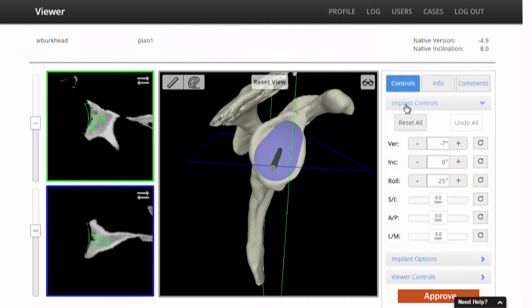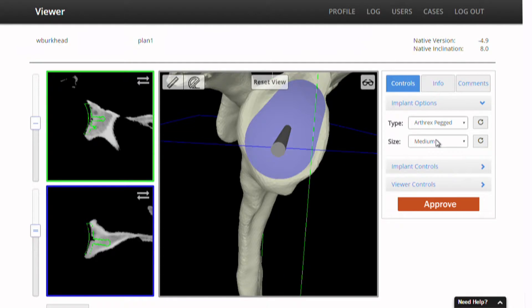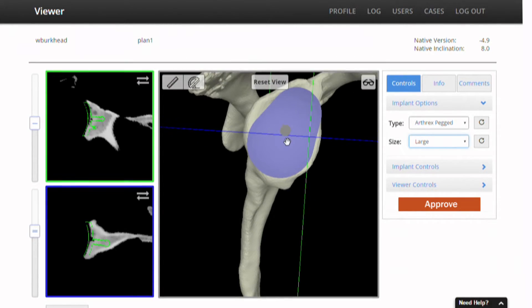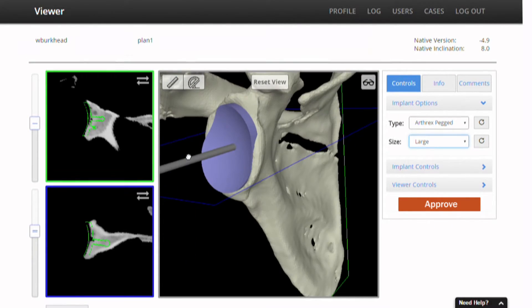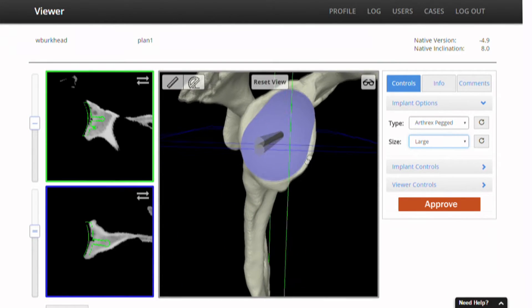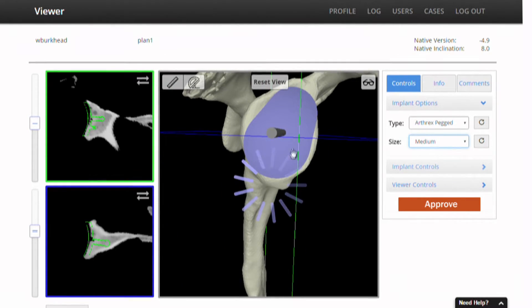Now you can change the type of implant you use with this, and we'll go to implant options. We might want to try to see what a large glenoid could do for this patient, but there may be a little bit of overhang here. This may be ossified labrum that may get debrided, so I'd probably stick with a medium component. And if you had a lot of deformity, you might want to use a keeled component.